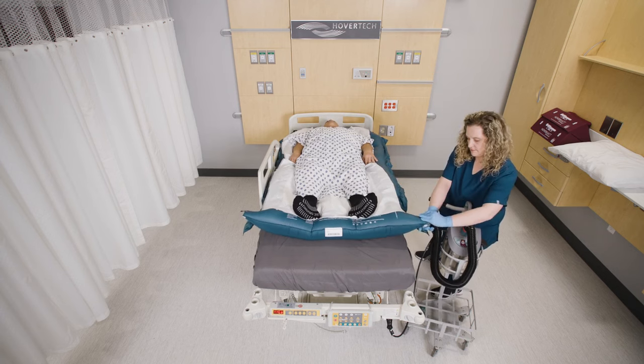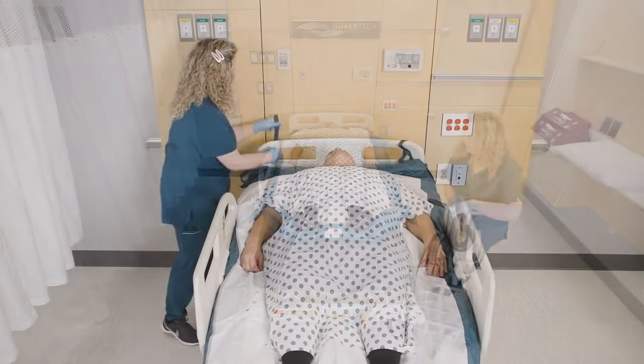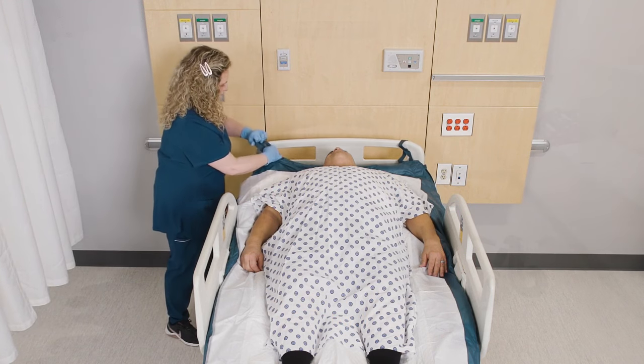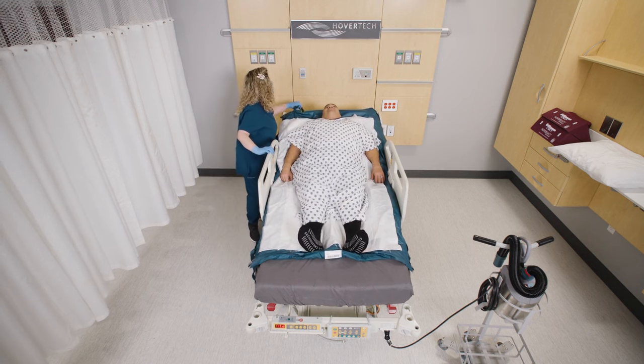Press the Standby button to stop airflow. Bring the patient back to a flat position. Remove the hose. Attach Velcro connecting straps to the bed frame to keep the mat in place and reduce migration. Raise the head of the bed and side rails or follow your facility's protocols.